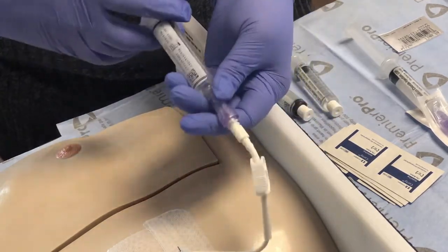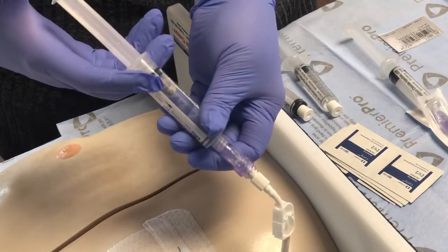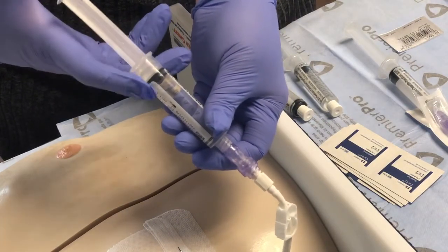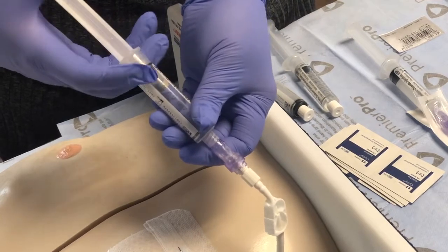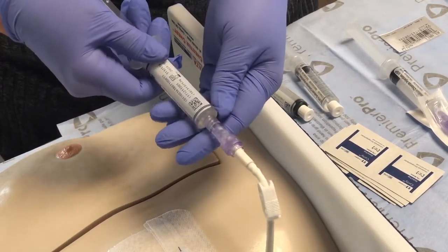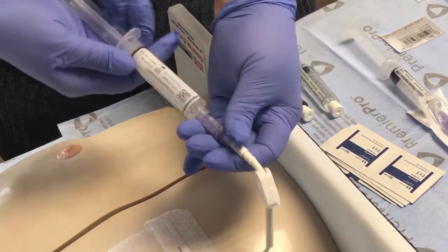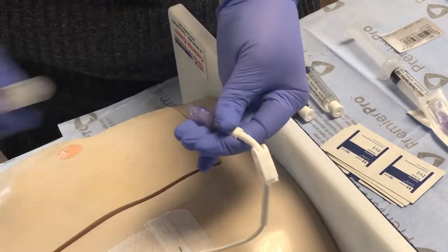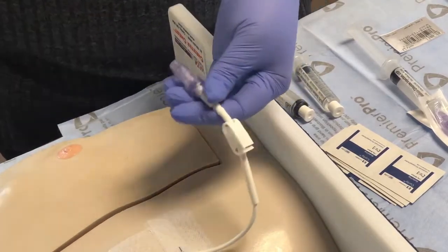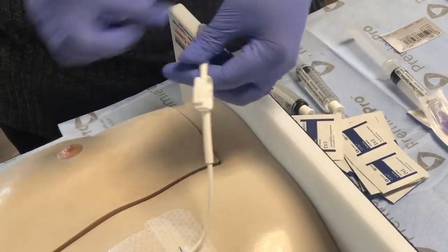Once patency is determined, flush the catheter using the pulsatile method. Push pause 1 ml each. Leaving the same syringe attached, you can draw the required 10 ml waste and discard. Scrub the hub and allow to dry for 60 seconds.